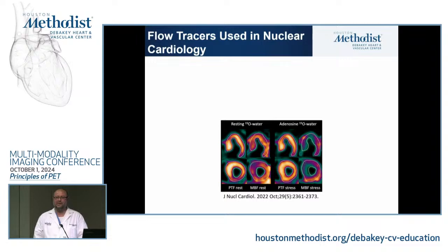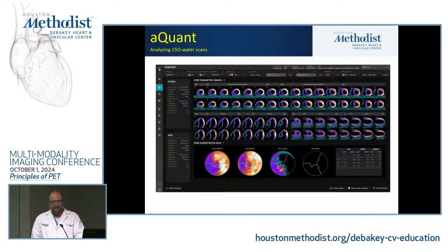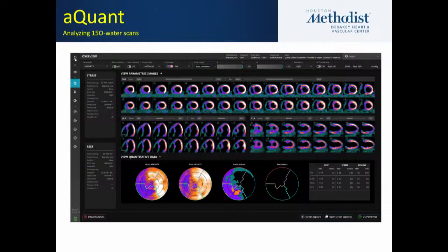And now there are some AI tools and some companies that are working to create some images from these based on early uptake. So very early when it goes inside before it becomes uptaken in the blood pool. So there is some research work that is trying to create some of these images, but they will not look as nice as you will see on F18 agents.